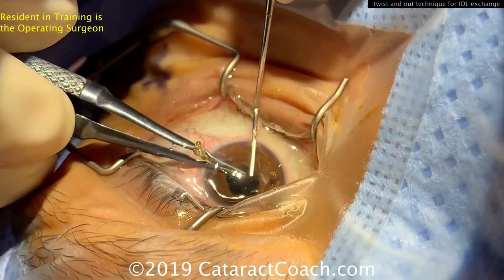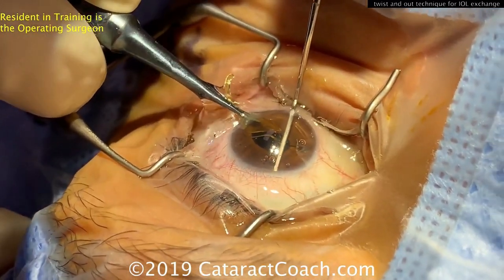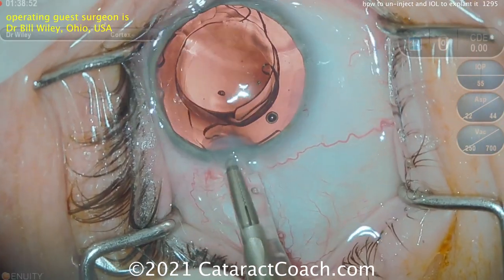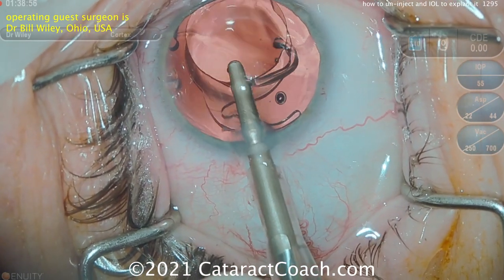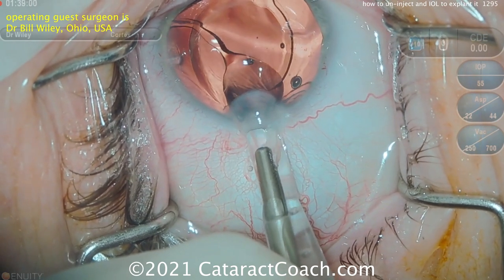Here's the view from outside the eye — you can see the resident doing it solo, rotating the lens and pulling it right out of the incision. And here's Dr. Wiley's video one more time: grabbing the edge of the optic with forceps and un-injecting it right through the cartridge — it works beautifully.